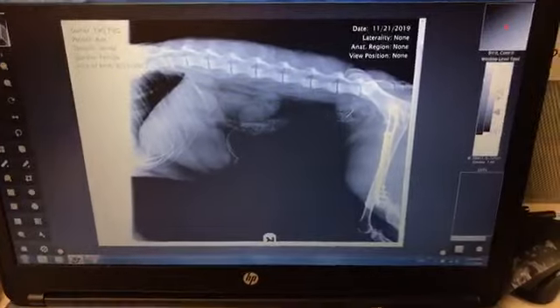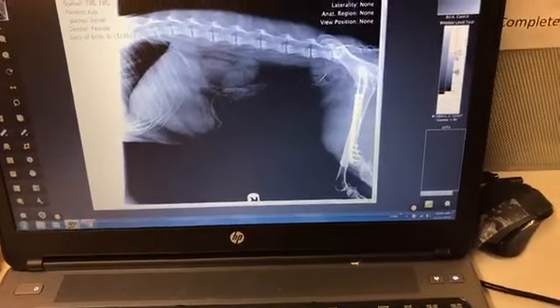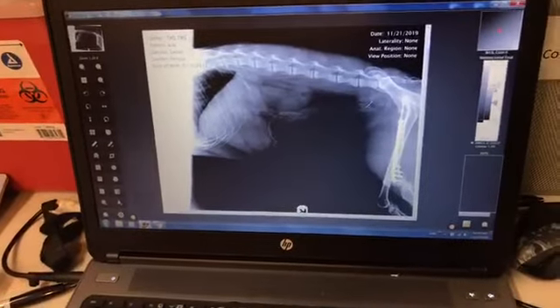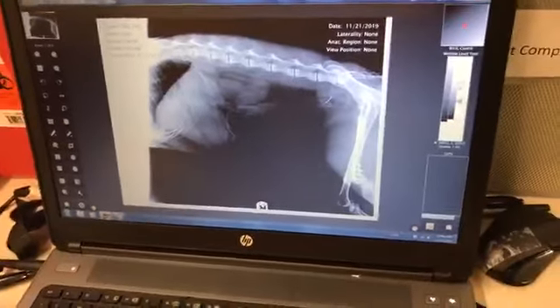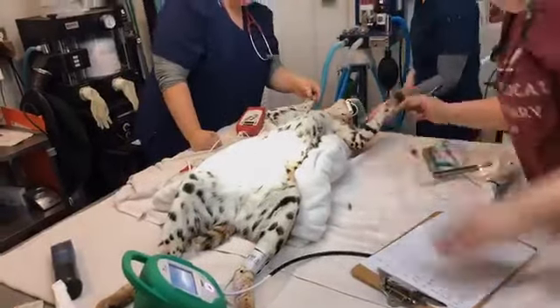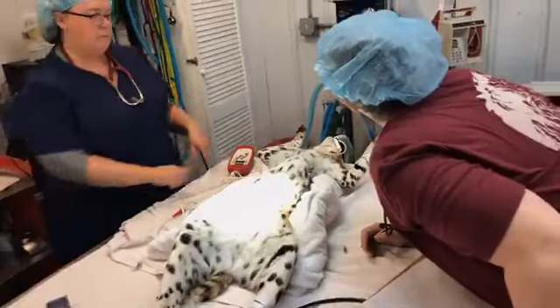Again, if you just tuned in, we just revealed that radiographs showed that Miss Ava here had a broken femur at some point. We are happy that it was plated by a veterinarian based on the radiographs. We know that is not the case with some of the other cats that came from this seizure, and it is why it is so important that we do radiographs on these cats, because we're going to see arthritic changes probably in that area faster than you would with a leg that hadn't had a fracture and been plated. Luckily with the plate, you get a lot of support there, but it's something we're going to watch. And when you add that onto her forepaw declaw, as she gets older, we're going to want to watch those arthritic changes and any pain management or any, sadly, regrowth that comes from declawing one of these cats.